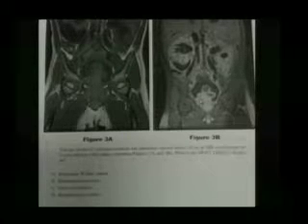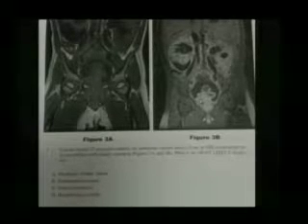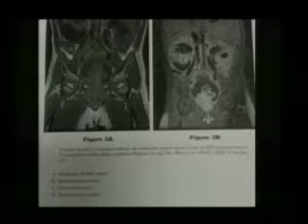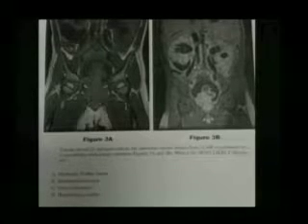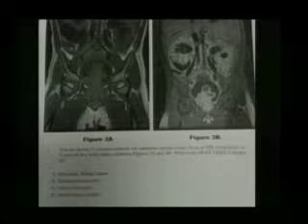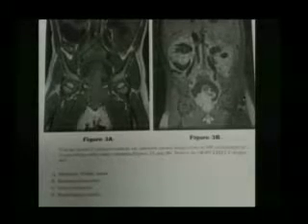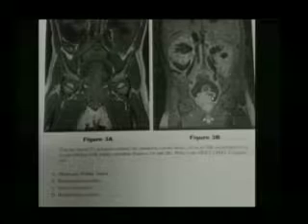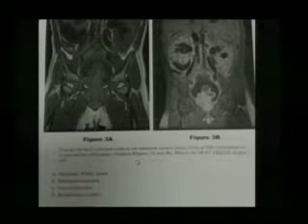The urinary bladder. In an infant and a young child, the most common bladder mass, if it's not a benign one like ureterocele, is a rhabdomyosarcoma. When they become older children and in adults, it's transitional cell. If you have a bladder dome mass in an adult, you have to worry that it could be a urachal carcinoma, which is an adenocarcinoma. But all the other ones are usually transitional cell, and this is a fungating polypoid-like mass, they call it like multiple grapes, and it's rhabdomyosarcoma.